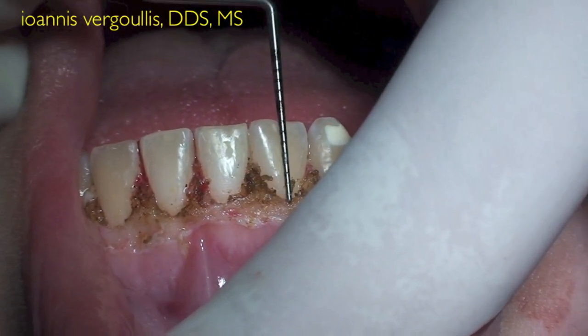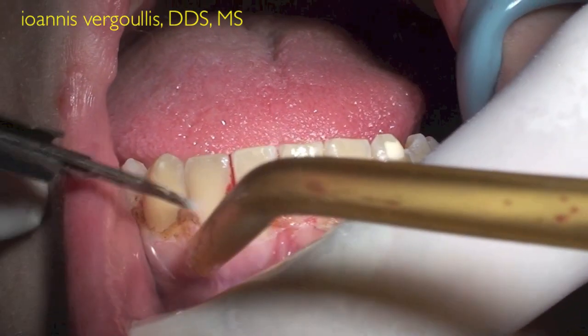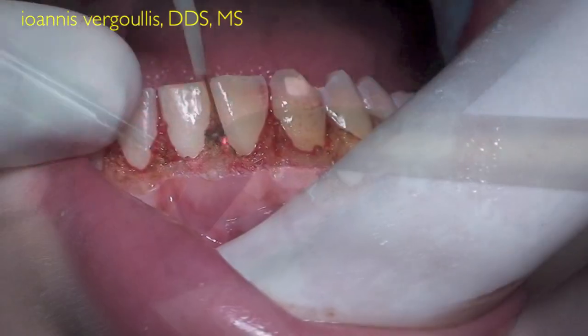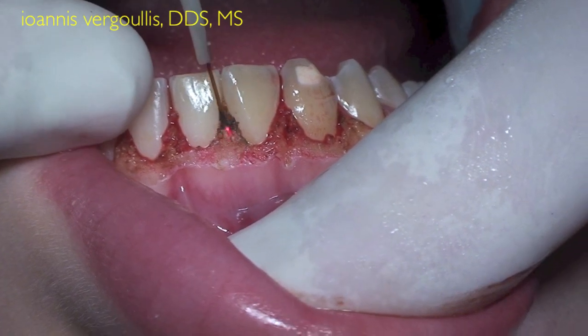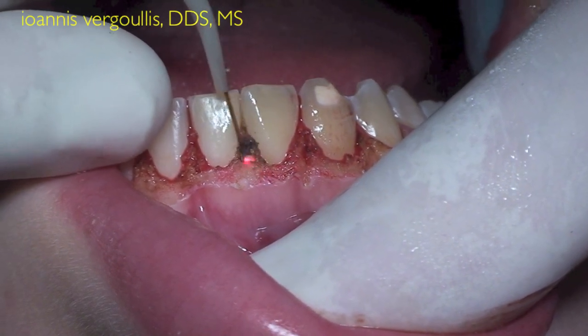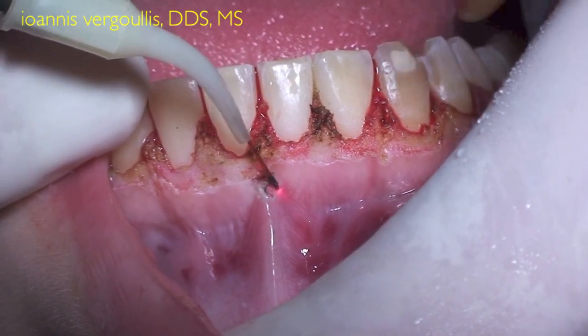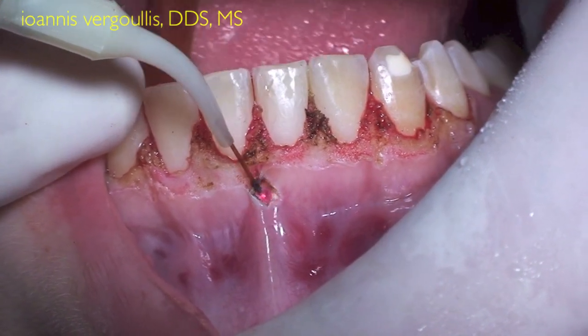At the end, we evaluate the tooth length. We cannot expose more because since we are not doing ostectomy, the tissue will grow back. So we stopped at the level that we have appropriate biologic width.